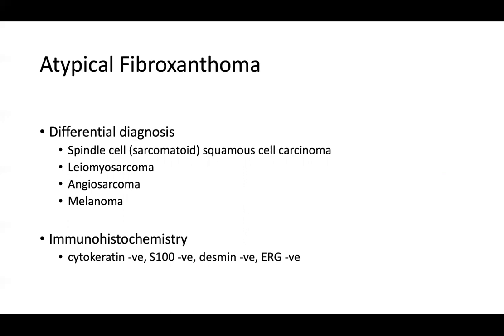So a P63 should be positive in the poorly differentiated spindle cell squamous cell carcinomas. AFXs should be negative for P63, so it's very important to know that. I'm pretty sure that there are AFXs out there that were poorly differentiated spindle cell squamous cell carcinomas that were P63 positive, but it just wasn't thought to test for the P63, so they were called AFXs.